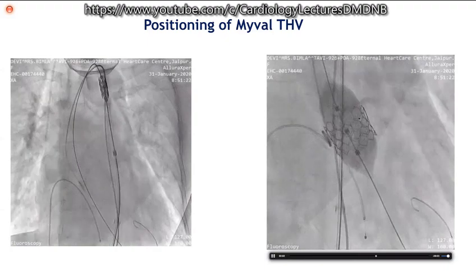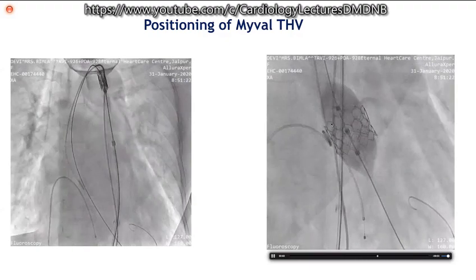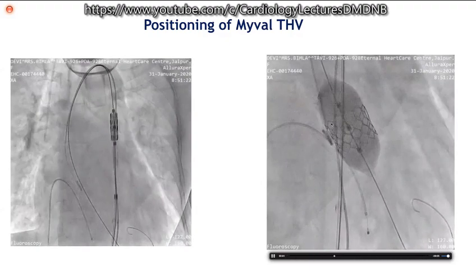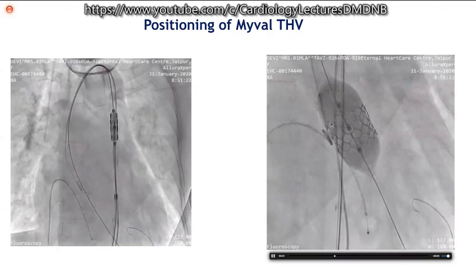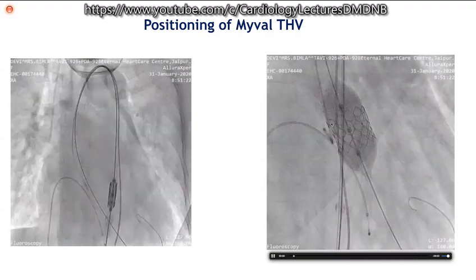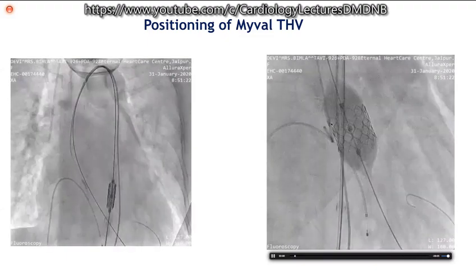So one important picture which is missing from this presentation is the way to implant, as was shown by Dr. Sigetas as well: you put the pigtail, do rapid pacing, and then inject 10 to 15 ml of dye. That dye is going to hang at the root because there is no effective cardiac output. So the dye will outline the entire annular plane and the valve can be deployed slowly.